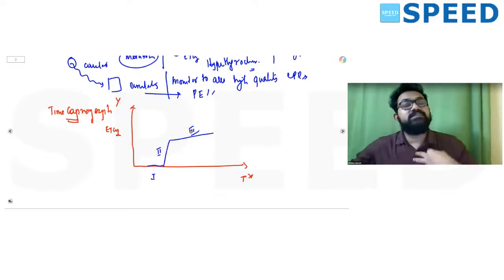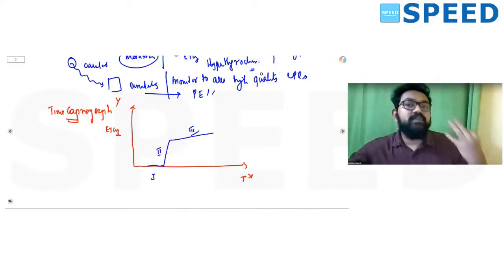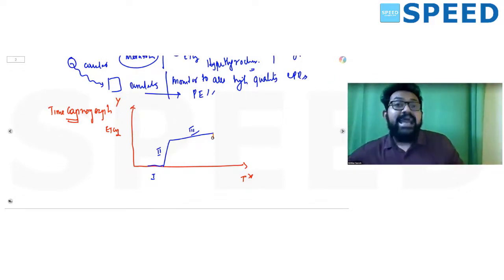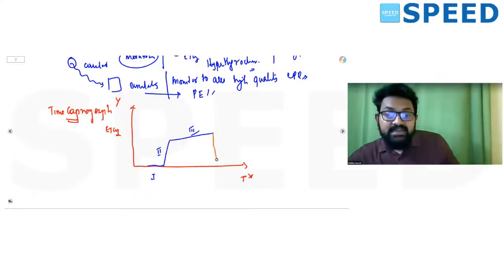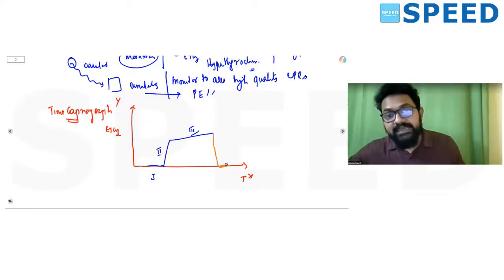And finally, once that alveolar air has gone out, there is an end process which is called as expiration. Finally, you are going to inspire again, and in inspiration you are not going to have any carbon dioxide. So there is going to be a drastic decrease in this particular value, right? So if you see this particular baseline here, this baseline is having some part of inspiration, and again this phase 1 is going to start.